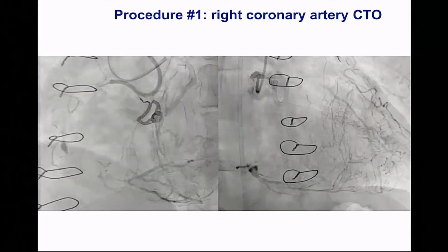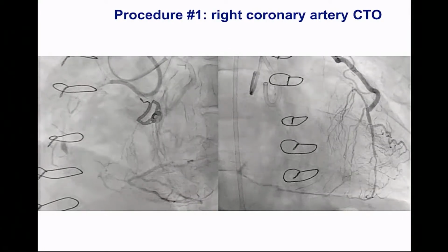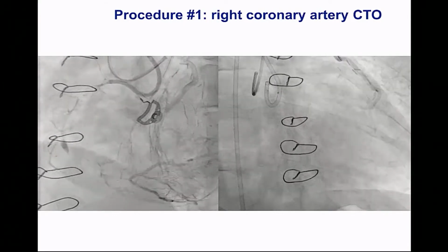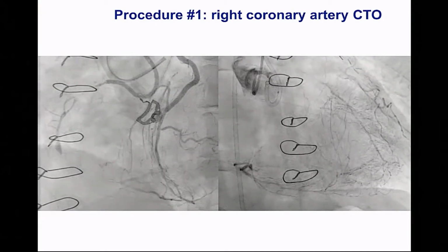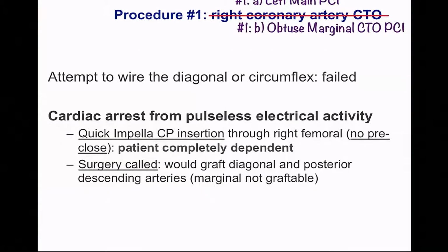So that's our first angiography. On the left, you can see that the RCA is pretty much the same. However, when you see the left system, there's something wrong going on, and you can't really see the left main. We were somehow in a state of denial. Is it the disease progression? No, it's probably a dissection. What should we do? So that was not anymore the RCA CTO we were aiming for. Now it's a left main PCI or OM CTO PCI.